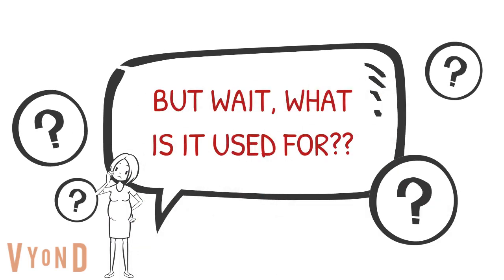But what is it used for? Well, ELISA tests can be used in a scientific world for diagnosing real-life diseases, infections, and viruses. For example, the ELISA assay is the most common test in diagnosing HIV, which causes AIDS. Through collecting an individual's blood sample for antibodies as well as oral fluid, through the use of this unique technique, it can also be used for confirming syphilis infections, Lyme disease, and it is also found in home pregnancy tests, just to name a few of the more common purposes of this assay.